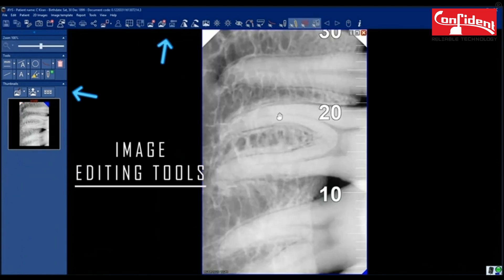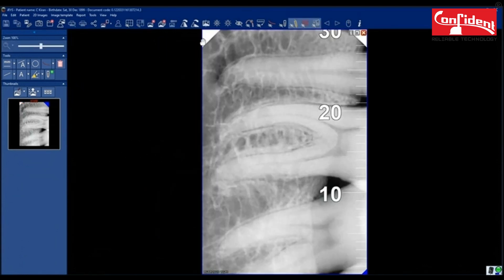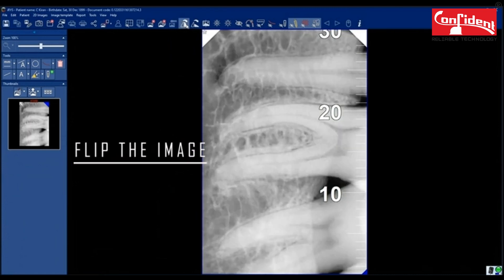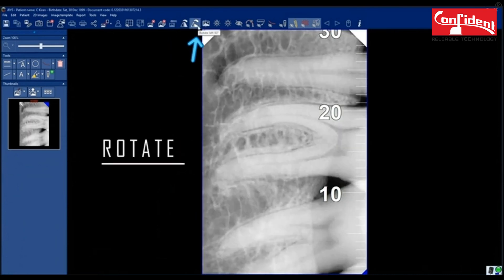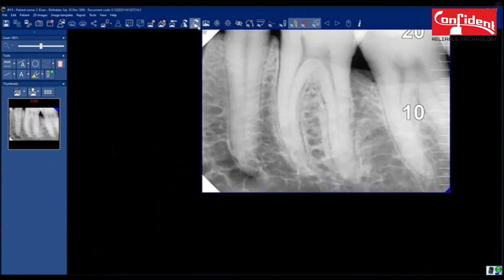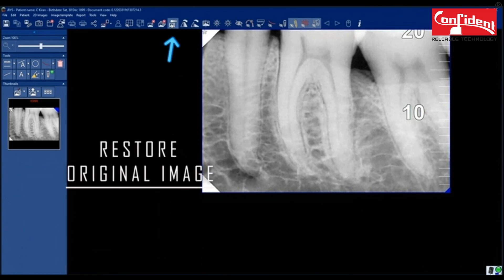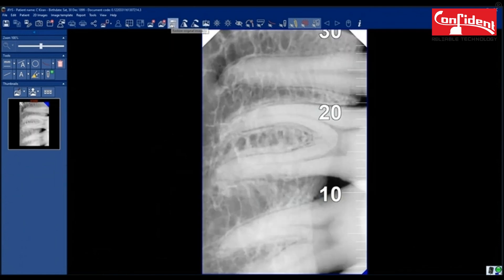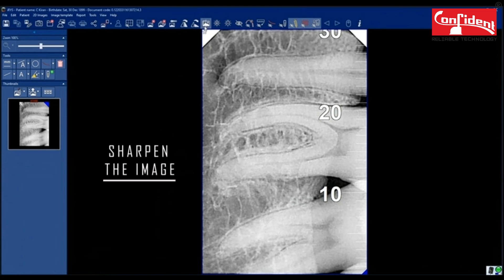You will find all the tools to edit the image. You can flip the image horizontally, rotate by 90 degrees. Restore to original image if you don't want the changes made. Sharpen the image.